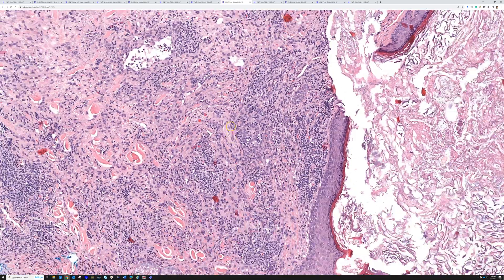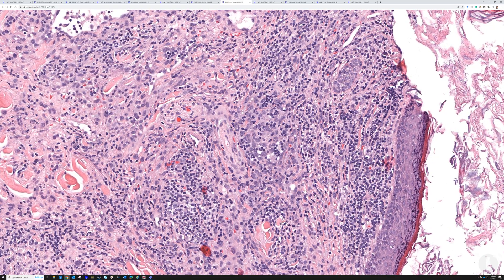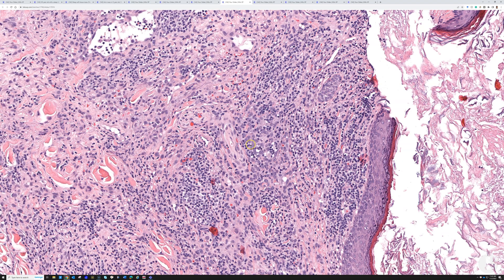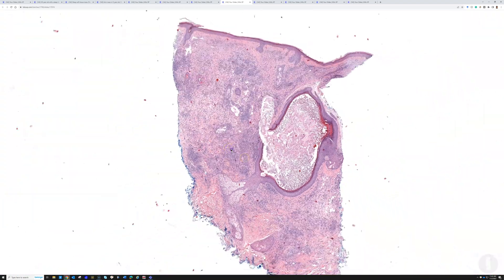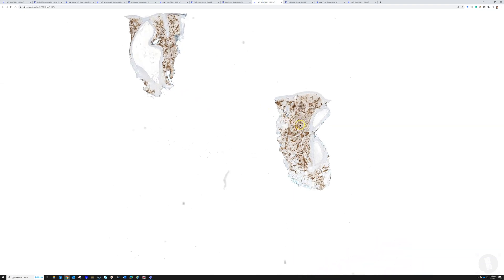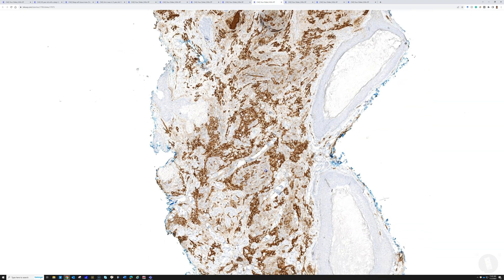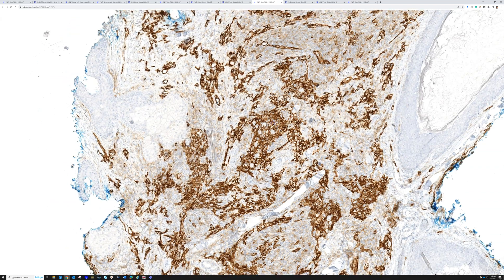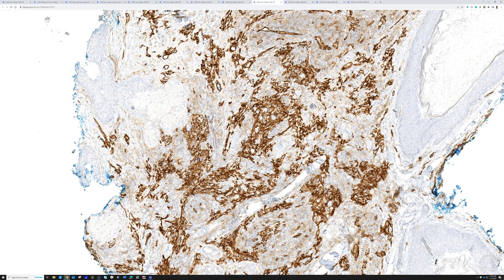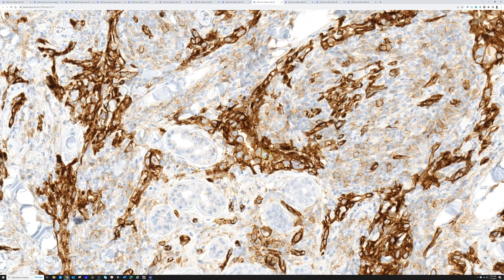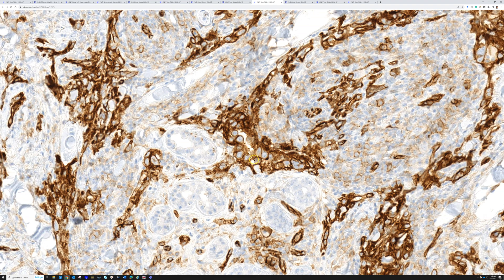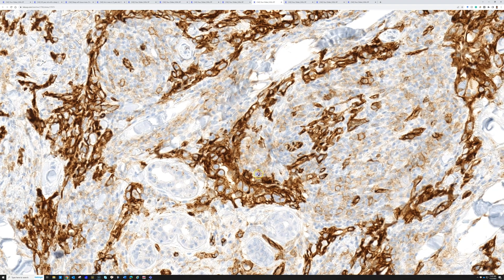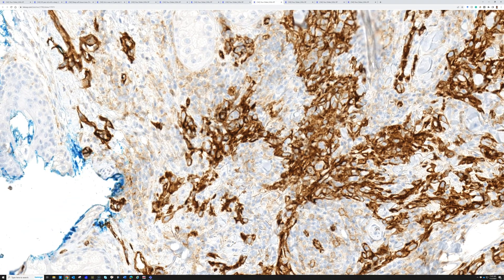I have to give credit to my former colleague — she was the one who first saw this case and recognized these cells in the background. She did a vascular stain, and this is CD31: all of those cells in the background are strongly positive. They are actually infiltrative, anastomosing vascular channels, with multi-layering and hobnailing of large atypical endothelial cells filling the vascular channels, which are anastomosing and interconnecting with one another.